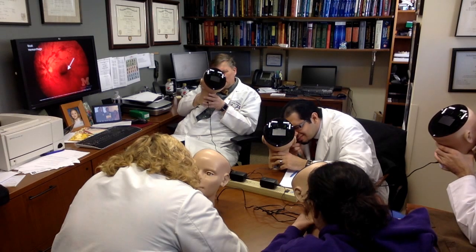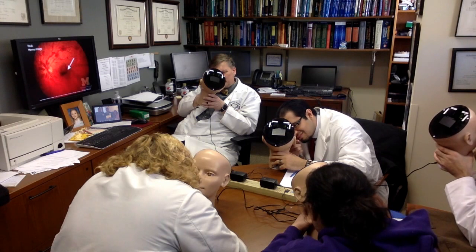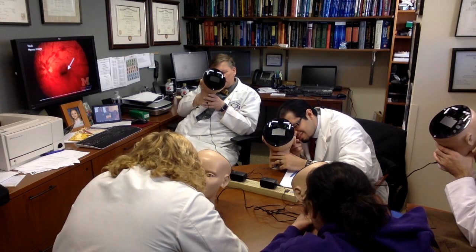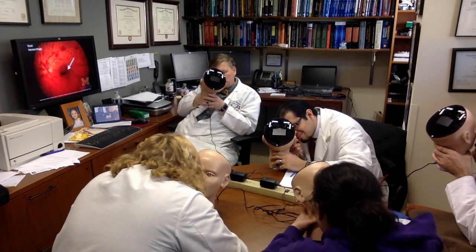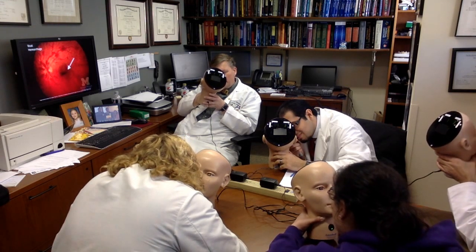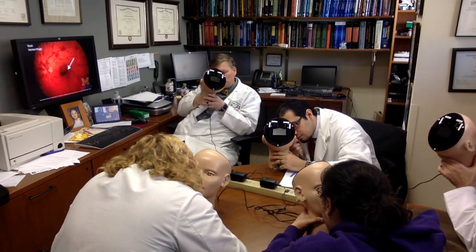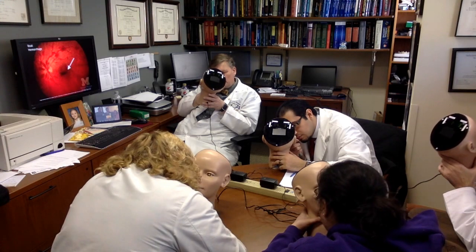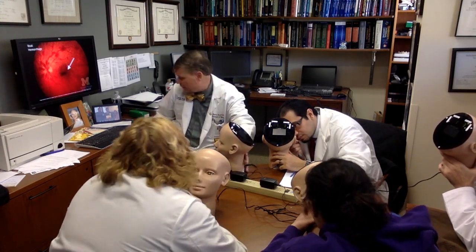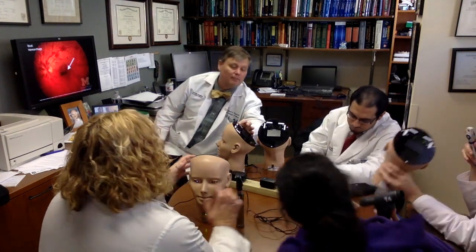So this is neovascularization. This is what happens in diabetic proliferative retinopathy. Now this will be more of an issue, obviously, for our ophthalmologists, but this is something that happens in diabetes. You can imagine how easy it would be for these to burst, right? They're so delicate. And this person has optic atrophy as well. Okay, so that's what happens in diabetes. Okay, let's go to number 30.